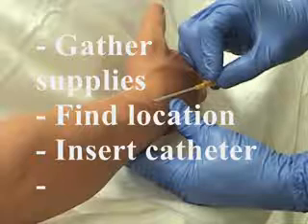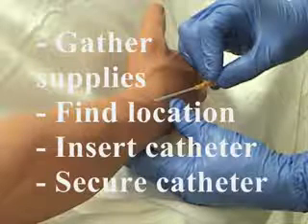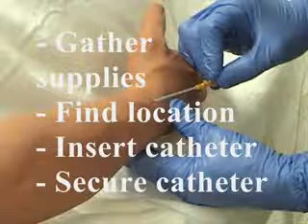Once the catheter is in the vein, thread the catheter off the needle and attach the lock and syringe. Remove the tourniquet, flush with saline, and remove the syringe. Finally, secure the site with opsite and tape. When attaching IV tubing, clean the luer lock with an alcohol prep pad. Attach the tubing, being careful to keep the tip sterile, and secure the tubing with tape to the patient's arm.